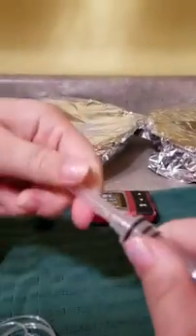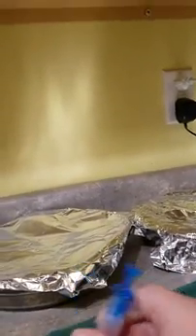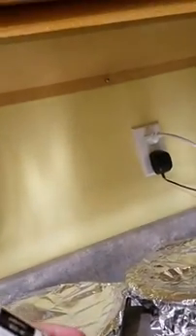Just be careful. I have stuck myself with that in the finger. It doesn't feel good. So you stick it in here, like this, right? And then you turn it upside down. Turn it over. And then we need to see the numbers, Michaela, there. You see the numbers on that?